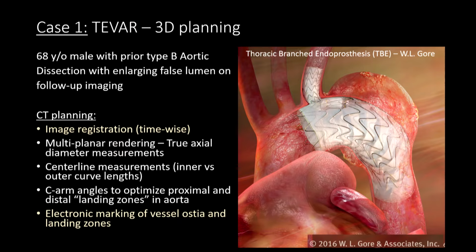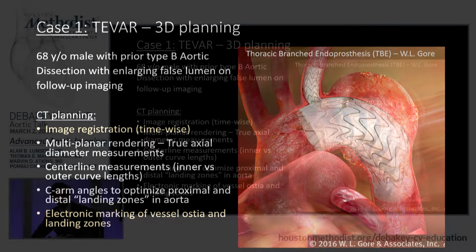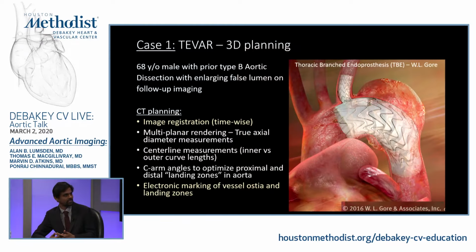So I'm going to focus mainly on intraprocedural image fusion, and I'm sure there are going to be a series of talks in this series on diagnostic CT and MR imaging, which our team here can speak for. But what I'm speaking for here is how we can take that data as it is today and use it for surgical interventions. And I'm going to start off with one of our cases that we have done recently together.